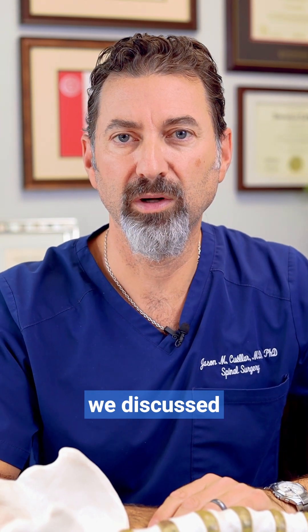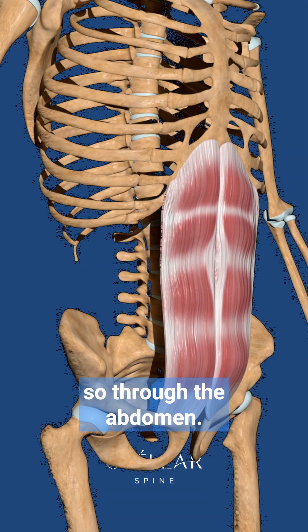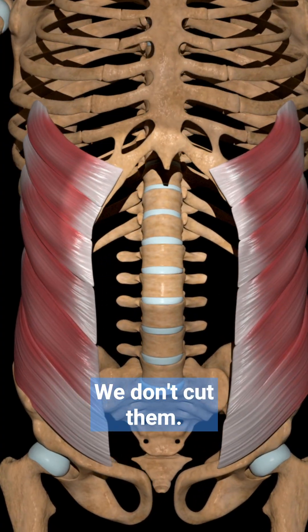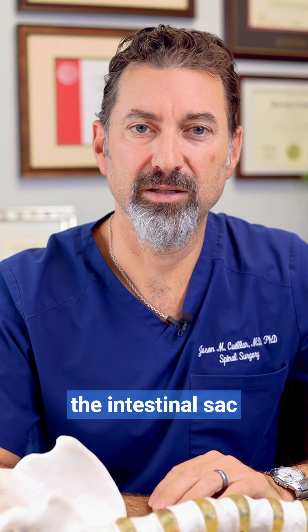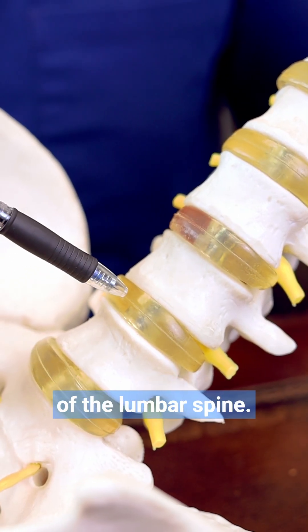In a previous video we discussed what a lumbar disc replacement is, and now I'll discuss how exactly it's done. We go through the front, through the abdomen. We go between the abdominal muscles — we don't cut them — and then we go behind the intestinal sac called the peritoneum, and we gain access to the front of the lumbar spine.